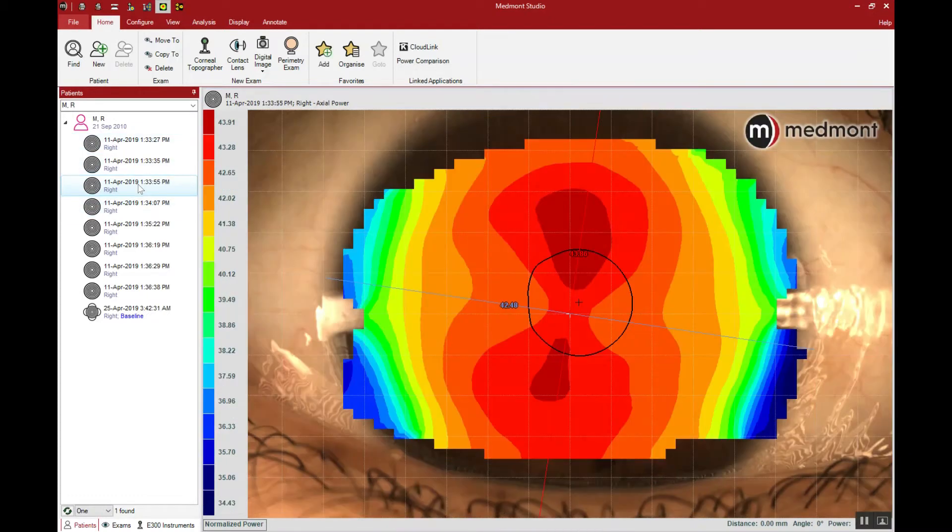When we pick just one of these topographies, you'll notice we're missing a bit of superior and inferior cornea. The eyelashes and lids may be blocking some of the ring reflection, and this can be common in the small fissure patient. We need to ask the patient to open as wide as possible. We can even use a little trick and pull down on the lower lid to move the lashes and any tear wedge out of the way so we can get more inferior cornea. One of the advantages of the Medmont is it gives us one of the largest surface areas of coverage with a single topography.